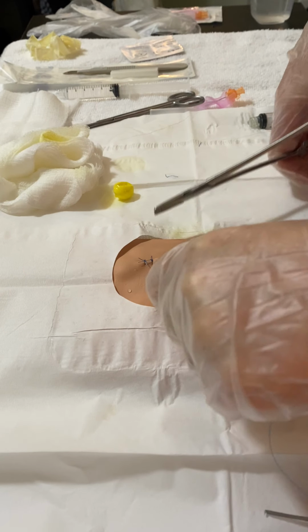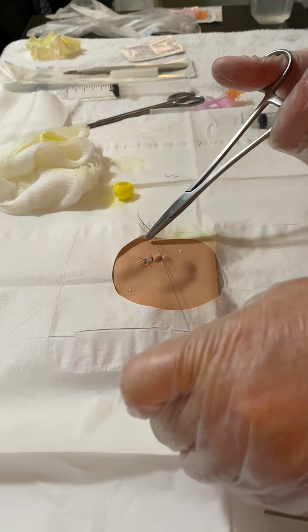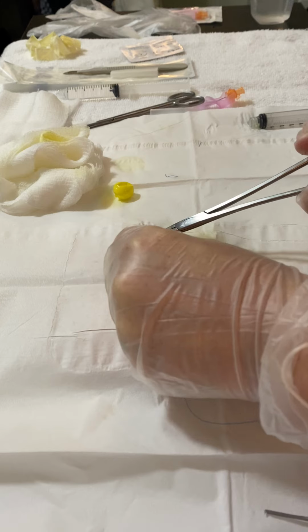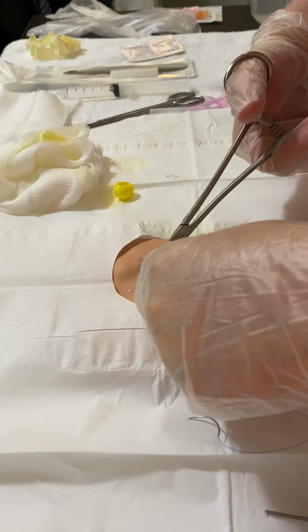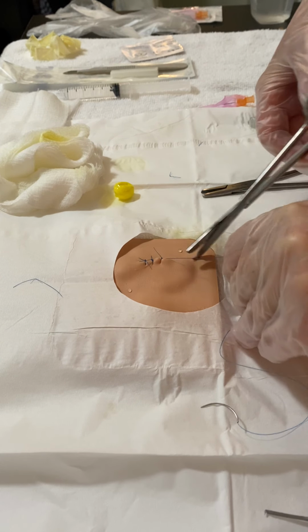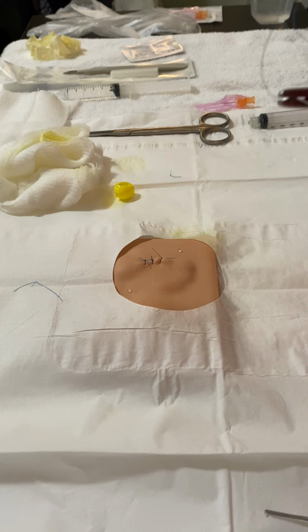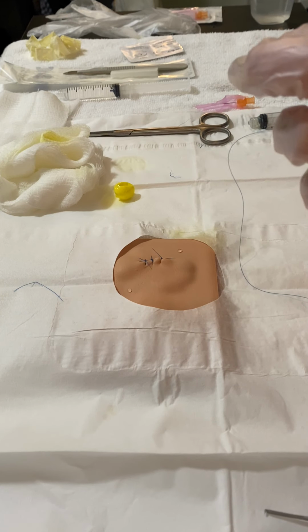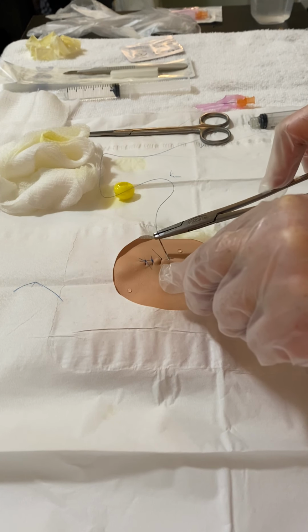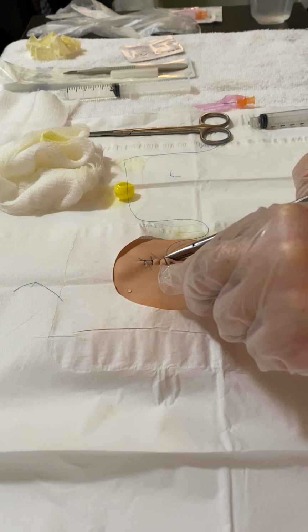1, 2, 3. And I think I'll go in and just do one more fourth suture at the base here, just to ensure that there's no open areas of the incision that could reopen.